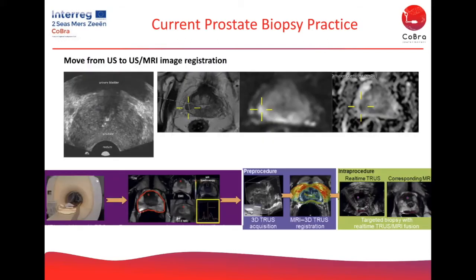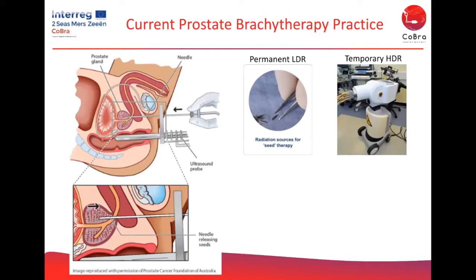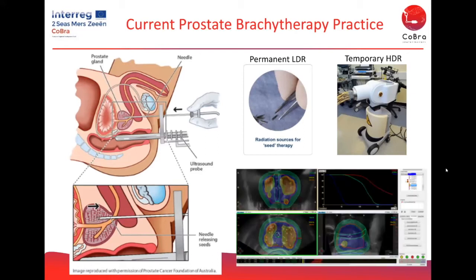Okay, so we were discussing the brachytherapy practice and the options for permanent and temporary brachytherapy. Whichever technique we are using, we will always have a computer planning system which we will use to individually plan, on a per patient basis, the distribution of radioactive sources so that we are covering the whole of a prostate. The prostate can be seen here in red, but sparing the organs at risk. So you can see how the hotter spots here, these orange and yellow colours, are avoiding the urethra, which is in green at the centre, and it's curving up at the bottom where we're trying to avoid the rectum.